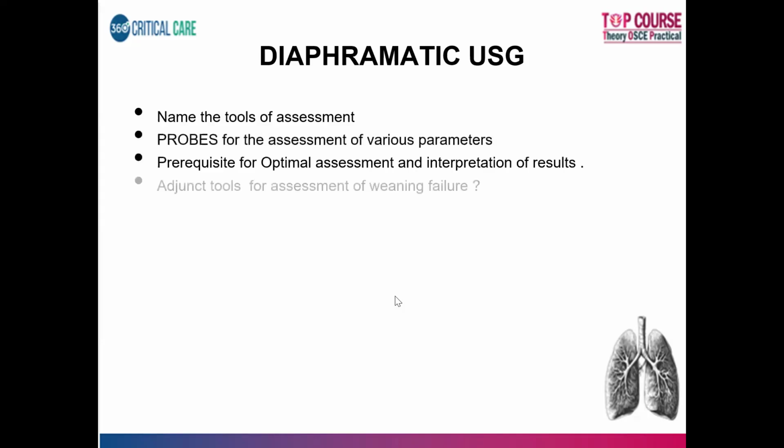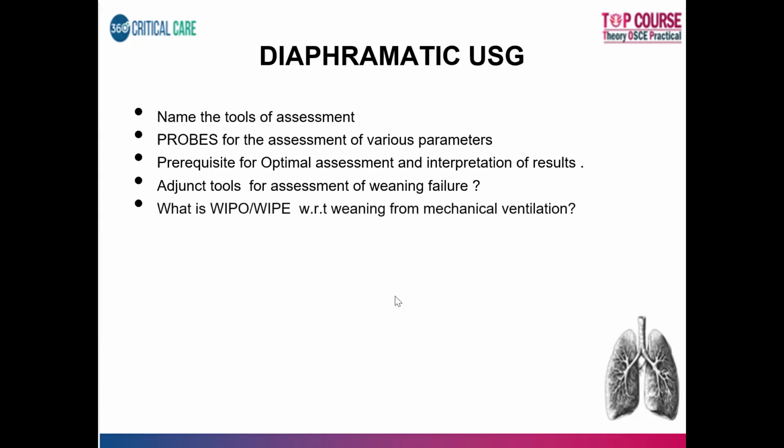One thing when you're looking at diaphragmatic ultrasound and weaning in general, you need to understand what is WIPE or WIPO. Can anyone expand this? WIPE. So WIPE is actually an acronym for weaning induced pulmonary edema. I'll be discussing these things in the further slides. These are the questions that they might ask you in your examination.